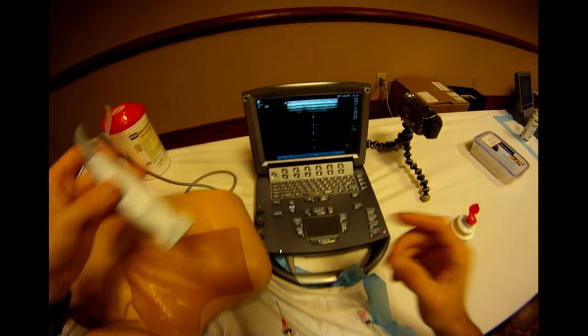I don't care if you've done this a bunch of times or if you're a novice with this. One of the pitfalls I see frequently is people getting the probe reversed when they're doing a transverse approach or even a longitudinal approach to the IJ. So what I'm going to demonstrate with this helmet cam video in a second is the sidedness of the probe and its correlation to its appearance on the screen.